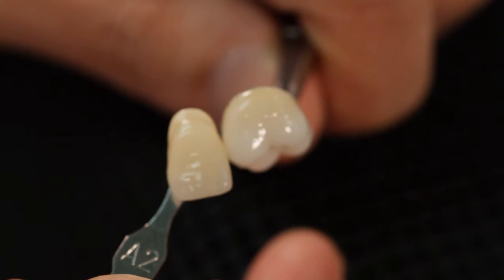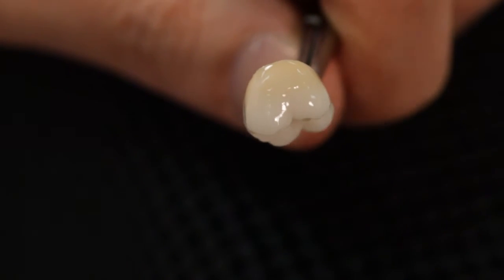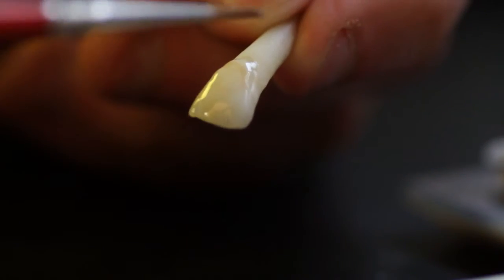Due to the unique properties, it takes a matter of minutes to individualize the surfaces of your crown and bridge work — to paint on white fans, decalcifications, hairlines, and crack lines, or to characterize your restorations.